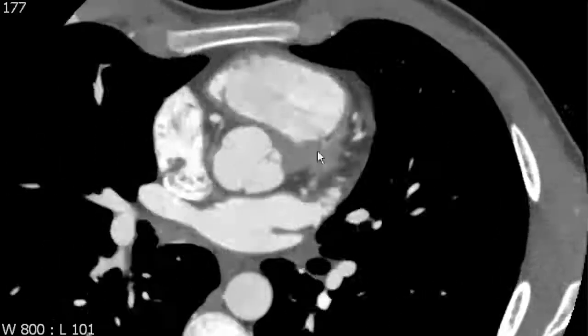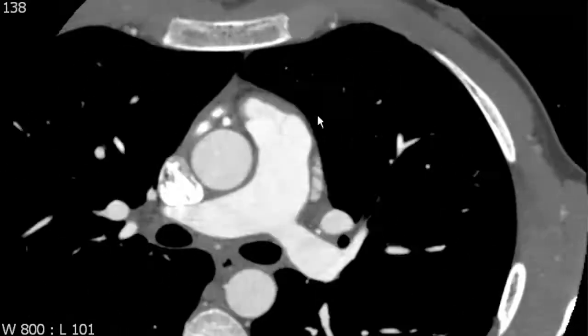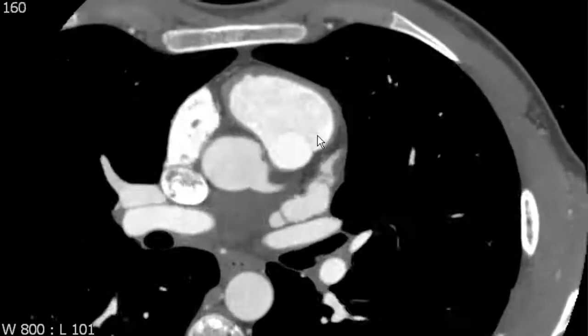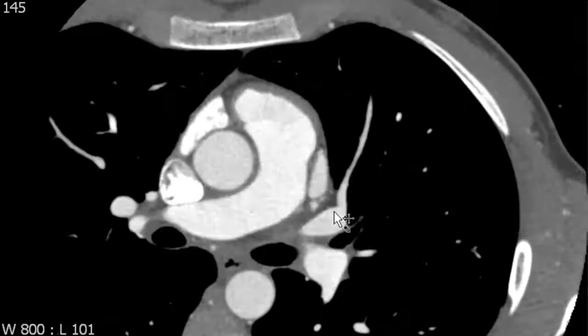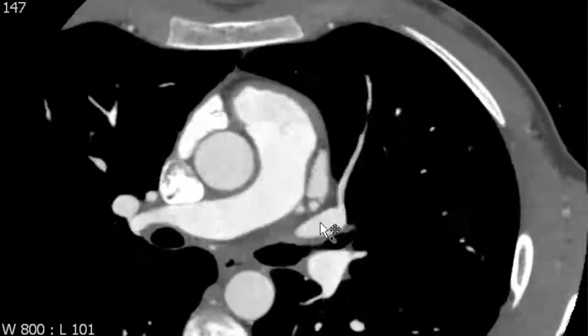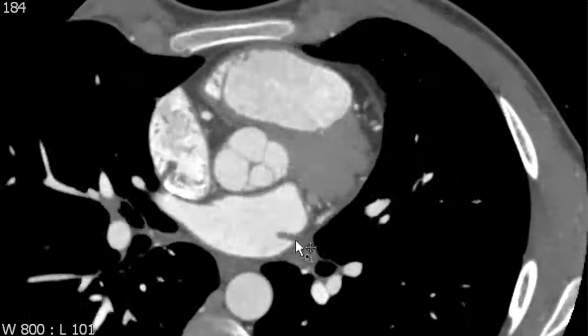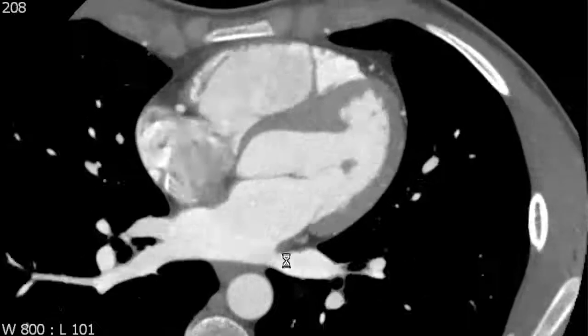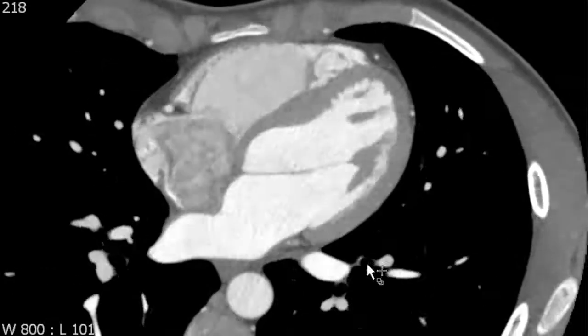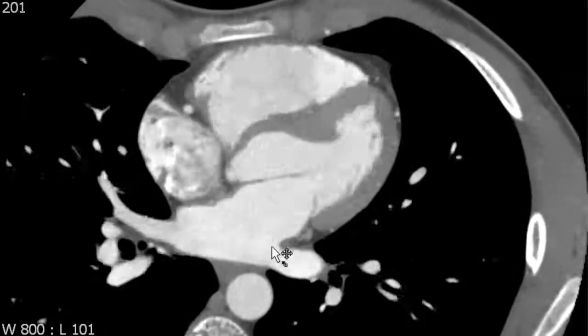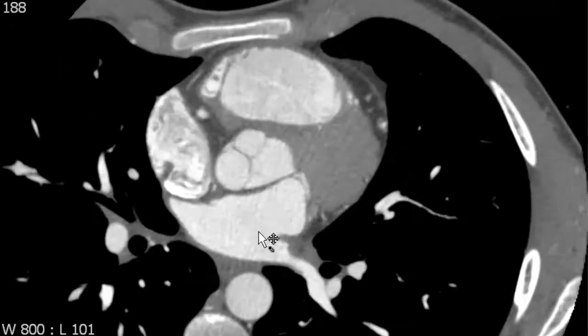On the left side of the heart, we can see that there's a superior pulmonary vein which drains into the left atrium, and then an inferior pulmonary vein which also drains into the left atrium.